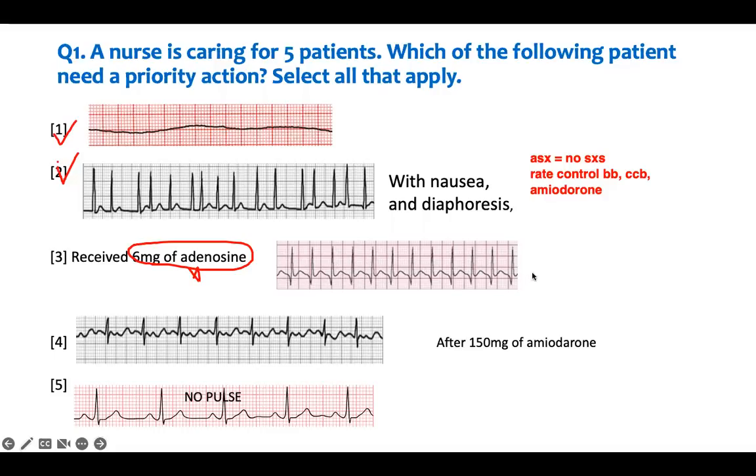That tells you the problem is above the ventricle, because you don't see a P wave, but you can see a good ventricular wave. So it's called SVT, supraventricular tachycardia. That means the ventricle is doing fine, but the atrium is acting up. So the problem is from above.